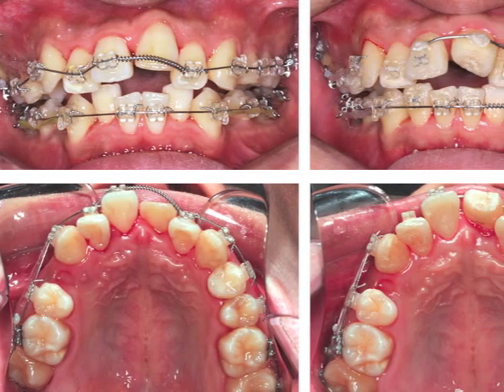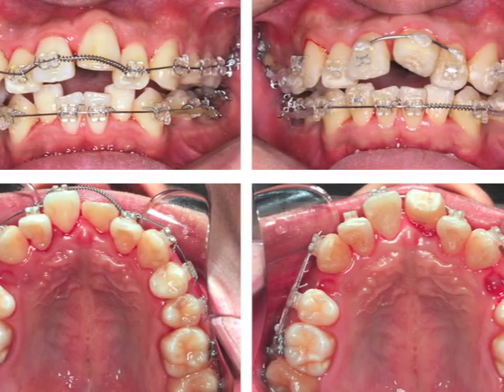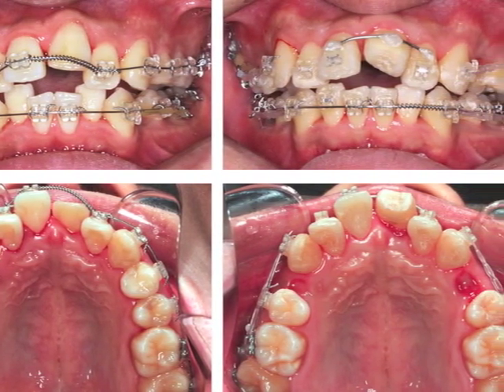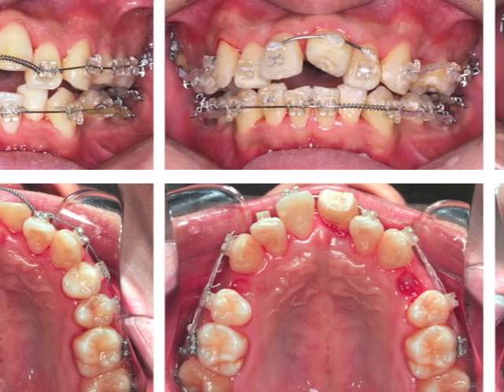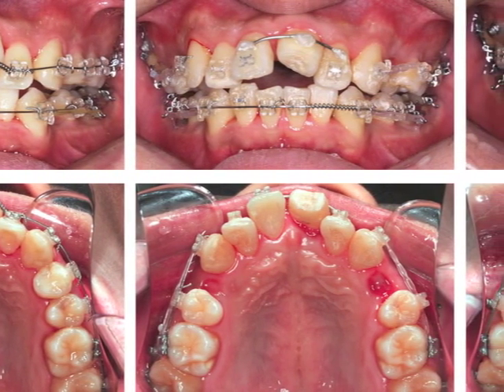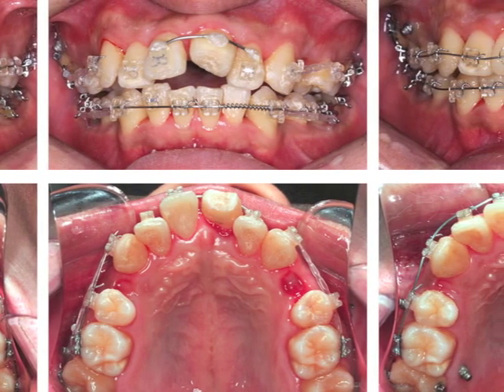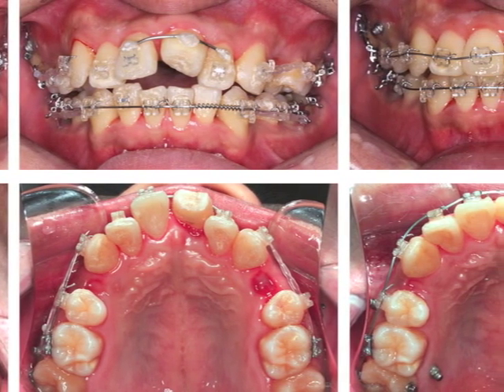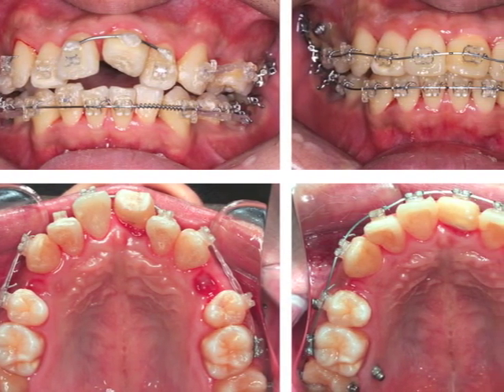From this progress image, you can see how the initiation of the alignment following these extractions and the use of coil springs could be employed to improve the success of any surgical procedures.